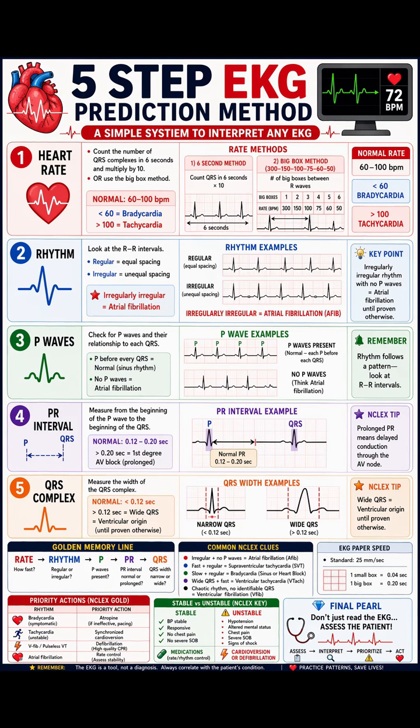Now let's move to the QRS complex. It is ventricular contraction or ventricular depolarization. This is the actual heartbeat you feel. Normal value is less than 3 small boxes, which is less than 0.12 seconds. Normal QRS is always narrow and sharp. Abnormal QRS is more than 3 boxes and wide. Abnormal QRS means there is a problem with the ventricle. For example, ventricular tachycardia and bundle branch block.